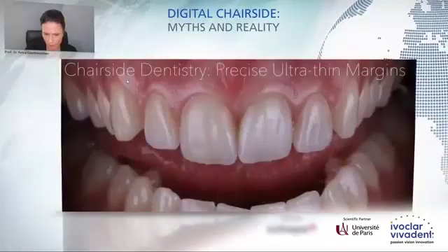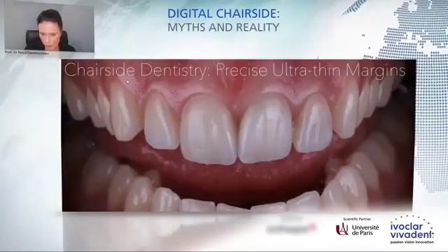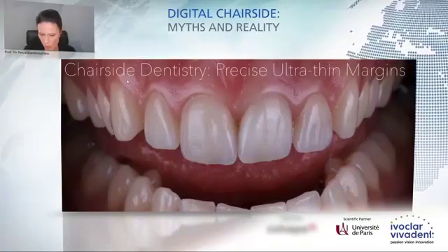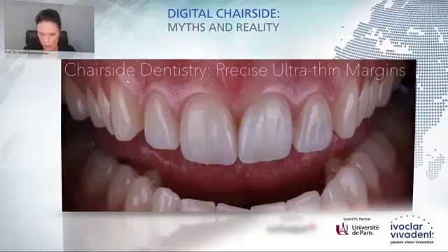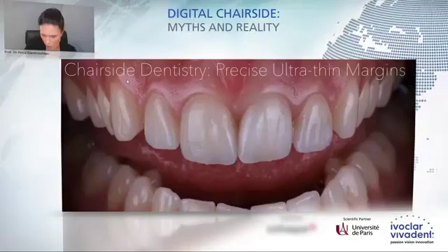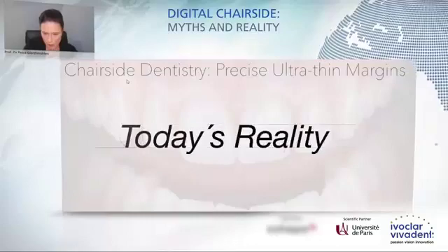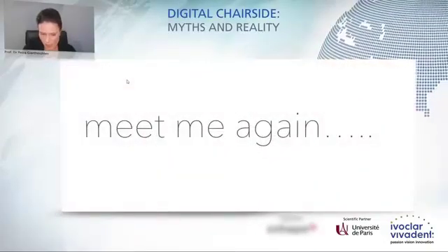And after that, we further characterize the restorations, but only with surface staining. And here you can see the final outcome of these restorations. I think it's really a beautiful outcome that we could obtain with this monolithic, only surface stained restorations and those beautiful, highly ultra-thin, well-fitting margins. So this is no longer a myth, it's a reality.